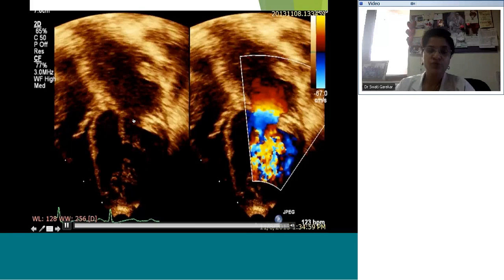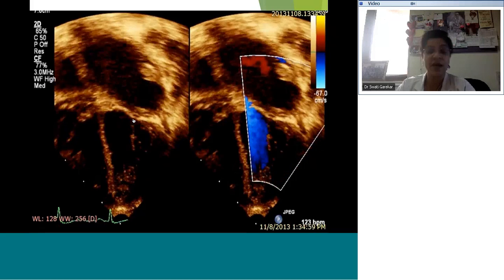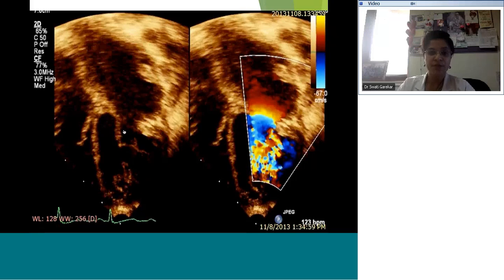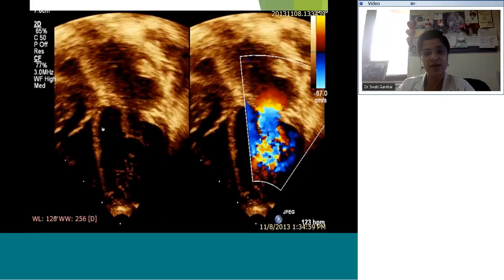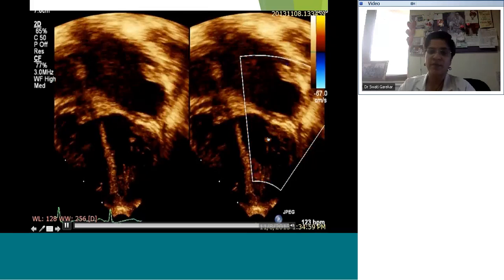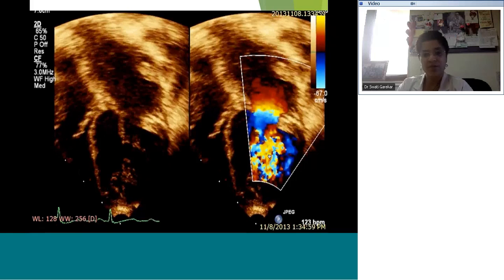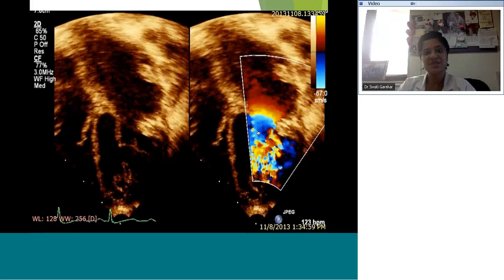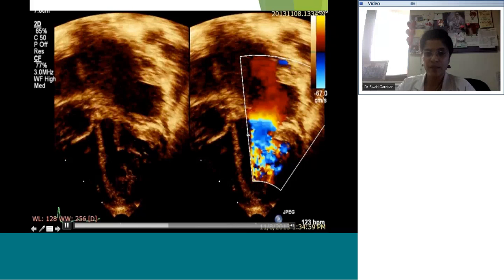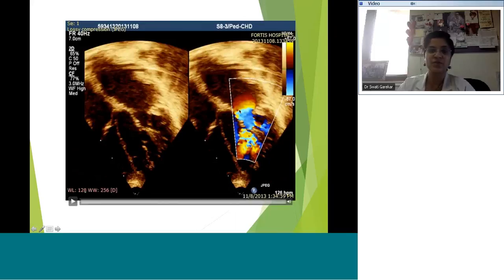An important point: if we've identified a supramitral membrane, we shouldn't pat ourselves on the back and stop there — I've learned this the hard way. We should move on and ensure the leaflet length is okay, the chordal length is okay, and the papillary muscles are okay. In this particular case there were lots of problems even in the sub-leaflet apparatus: the chordae were short, the papillary muscles were not well-formed, and this was also a double orifice mitral valve. Addressing only the supramitral membrane did not do the trick.